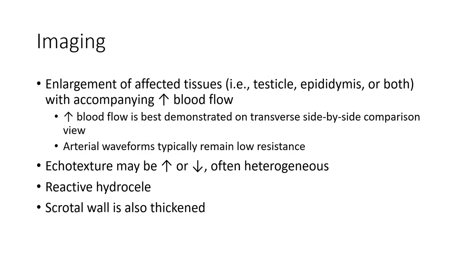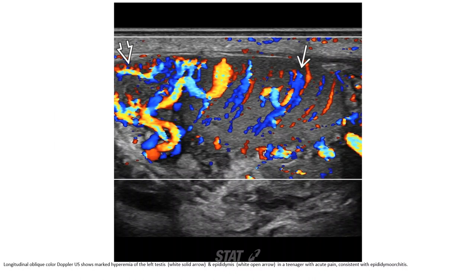The scrotal wall is also thickened. This is seen on scrotal ultrasound. Marked hyperemia of the blood flow to the testicles and epididymis in a teenager with acute pain is consistent with epididymal orchitis.